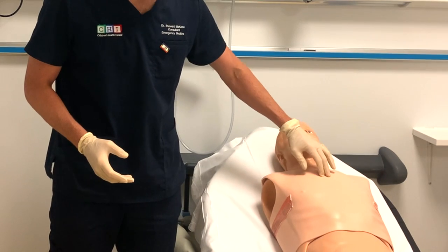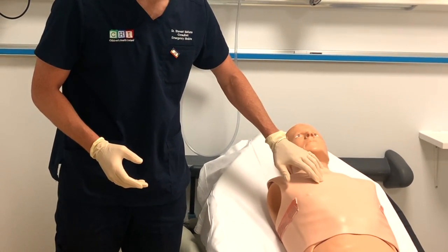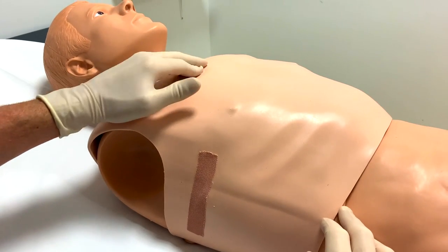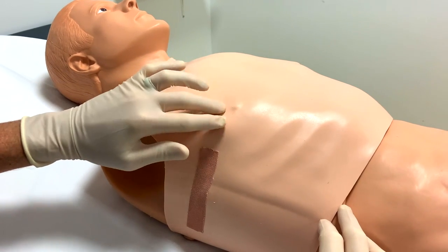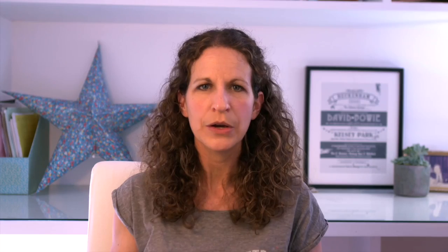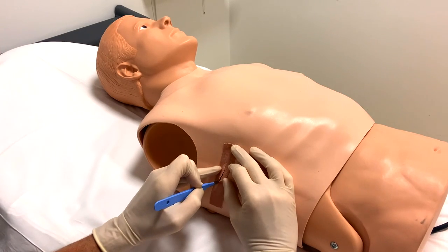To find the child's fourth or fifth intercostal space, abduct their arm to 90 degrees and feel for the sternal angle. Lateral to that is the second rib. Slide your finger down over the second rib to the second intercostal space and walk your fingers down the spaces to the fourth or fifth space, then slide your finger along the space laterally to the mid-axillary line. Once you're there, get your scalpel out and make a two to three centimetre incision along the upper border of the rib below.